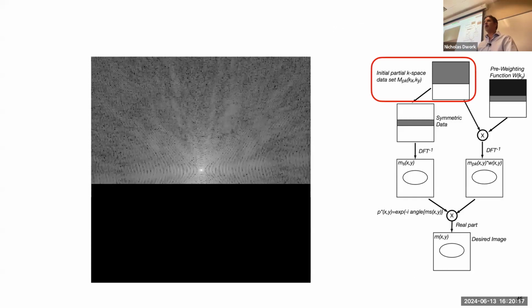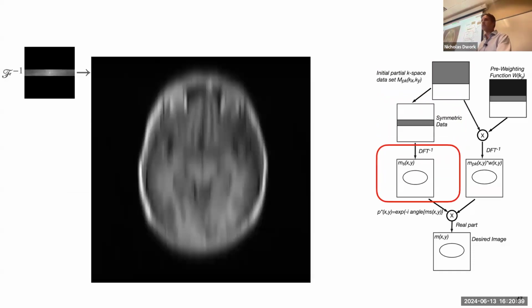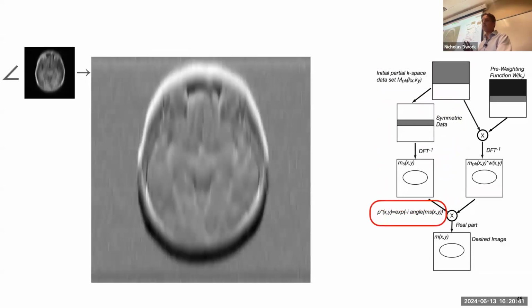So you sample slightly more than half of k-space, maybe 5/8, maybe 9/16. You look at just the center of k-space, and you assume that the phase is contained within a center region, a low-pass filtered version of your image. You reconstruct the image and estimate its phase. So now we're down here.